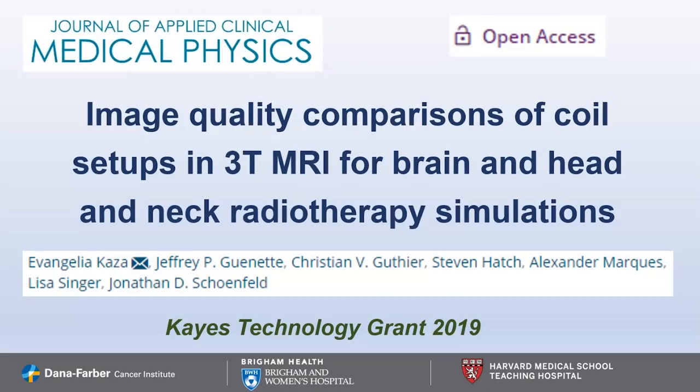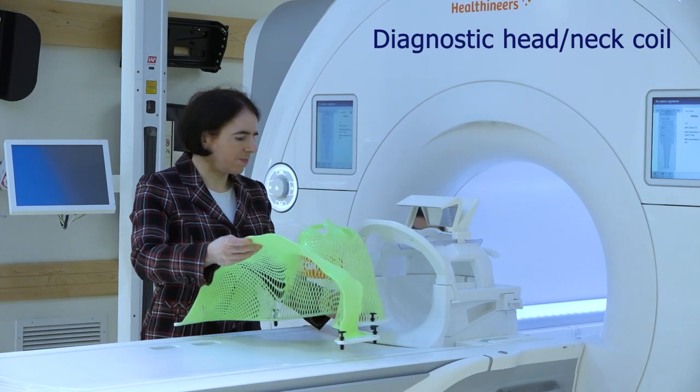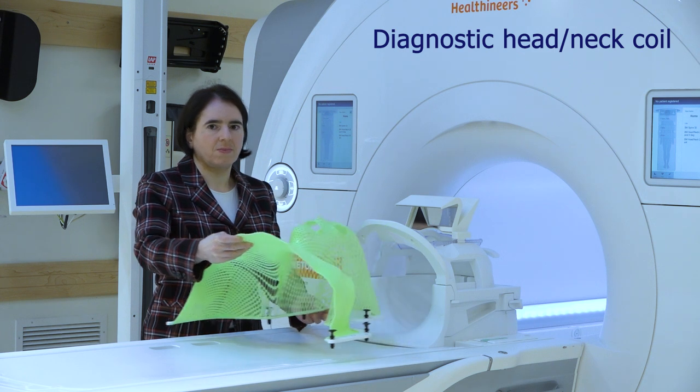Magnetic resonance imaging is increasingly used for brain or head and neck radiotherapy treatment planning, but the thermoplastic masks used for patient immobilization don't fit inside the diagnostic head and neck MR receiving coils.